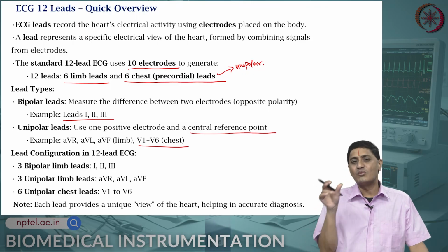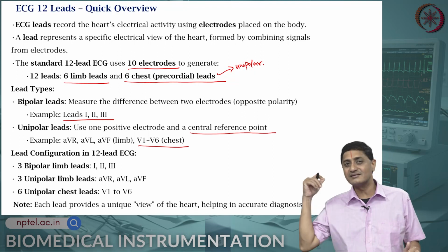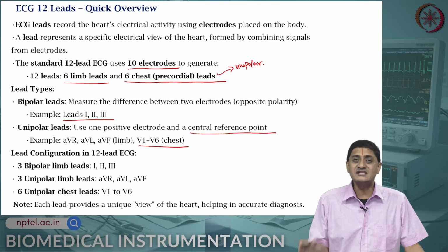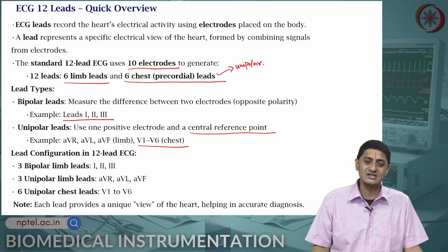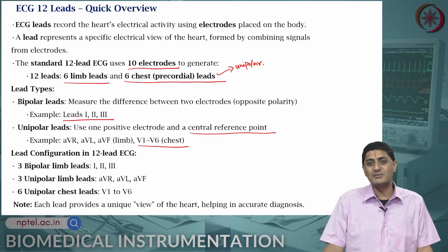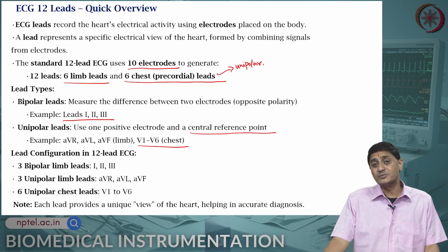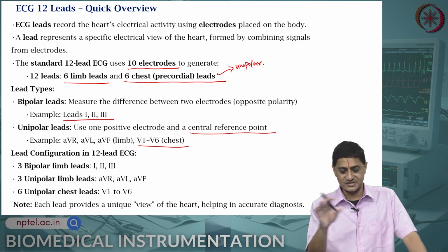This is like having one camera in front of the house, one on the side, one on the back, another on the other side, another from a top view and so on. Likewise, each lead provides a distinct view of the heart, thus helping in accurate diagnosis. It is not like one lead is more important than another. All of these leads contribute to the total diagnosis.